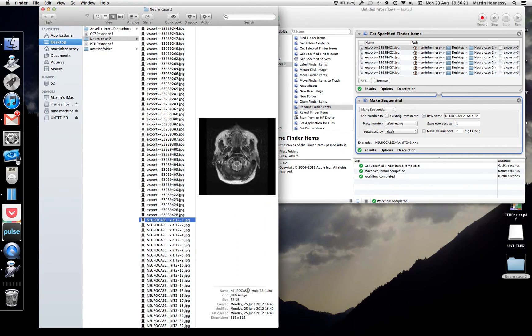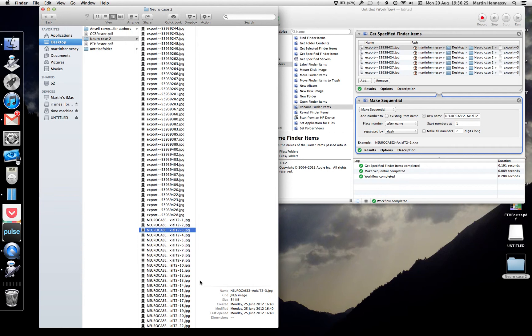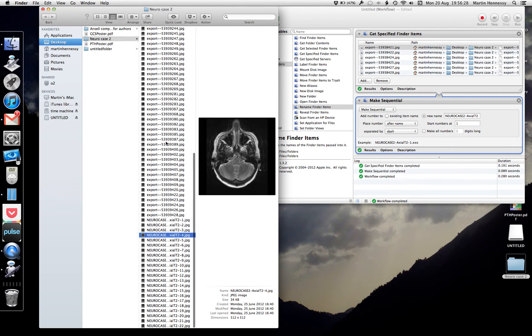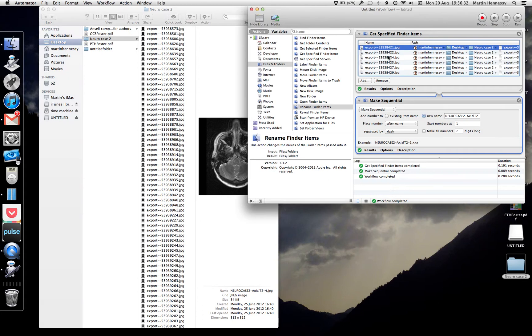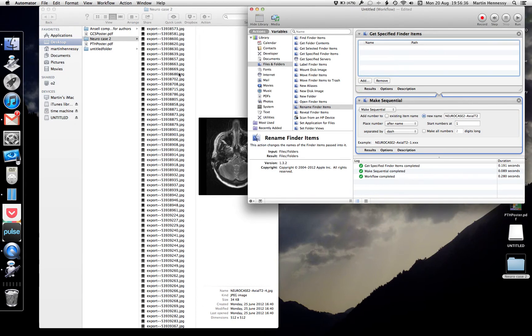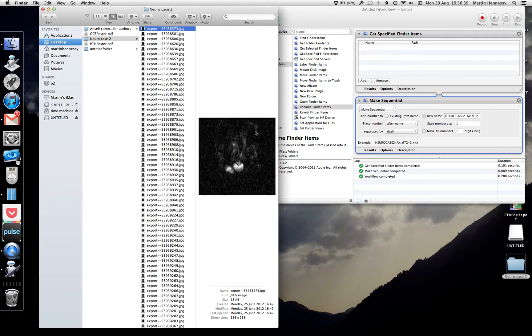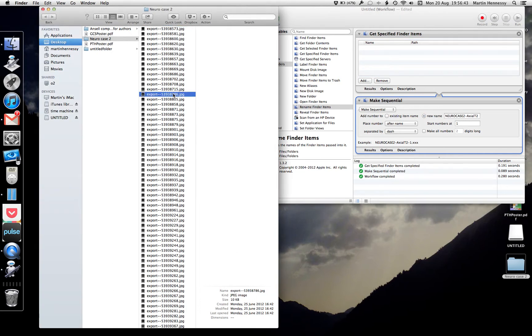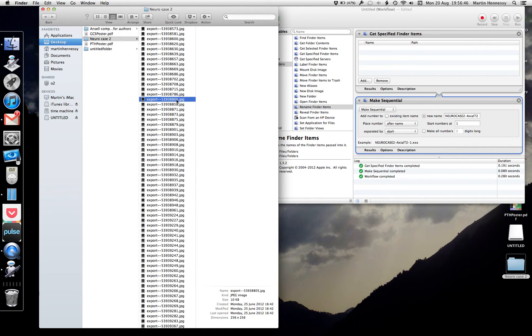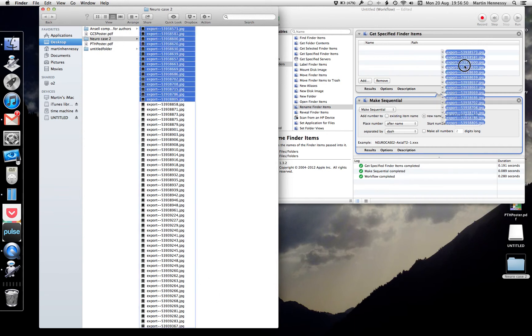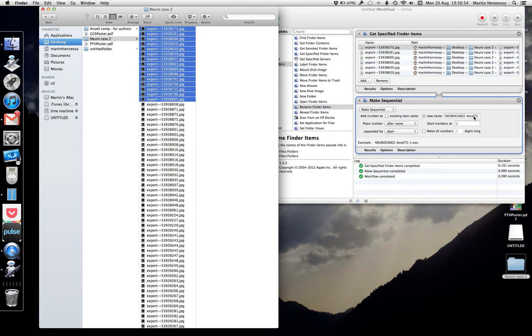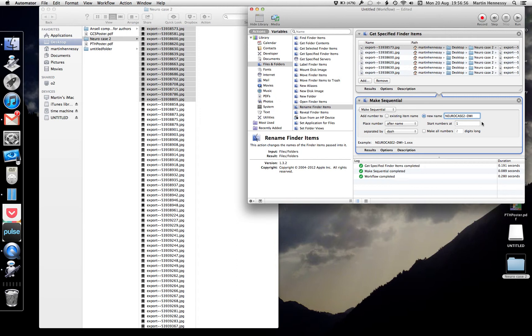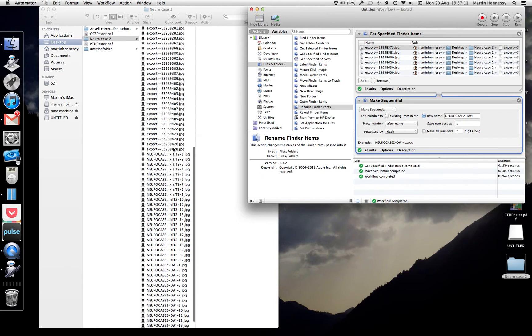It now displays the full name — neurocase axial t2, slice 1, 2, 3, 4 — good. I need to do that for all five series, so I'll do the rest a bit quicker. Command-A to select all and remove them. This next group looks like the diffusion series, and it goes up to 805. I don't know whether these are b-naughts or whatever — we'll just label it DWI. I know there's only one diffusion sequence, so I've dragged them all in in order and changed the name to 'neurocase DWI'.